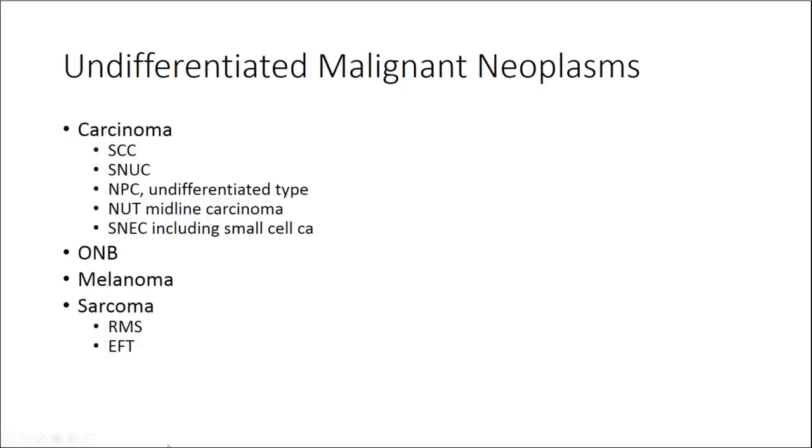And I think if we look at this, lymphoma is probably not one of the first things I'd be thinking about. If you're worried about it, you could do an LCA or CD45 to confirm that it's not lymphoma, but that would be one thing that I would not think about. But we also added one thing to our differential diagnosis, and that was adenoid cystic carcinoma. Because of that nested appearance and that myxoid stroma, we thought about a high-grade adenoid cystic carcinoma. So it was one thing that got added to the differential.